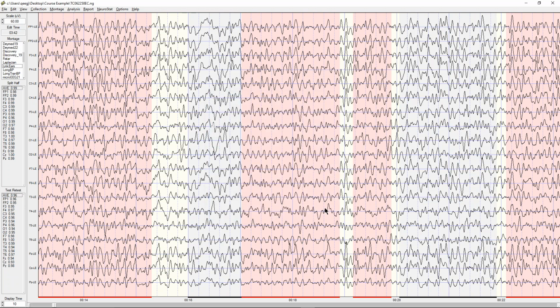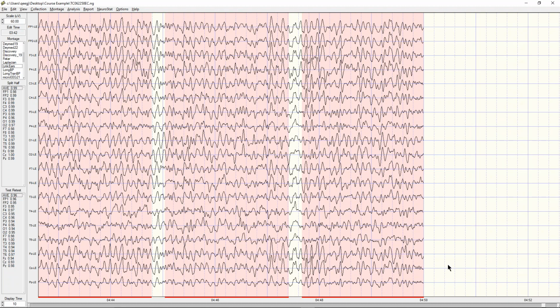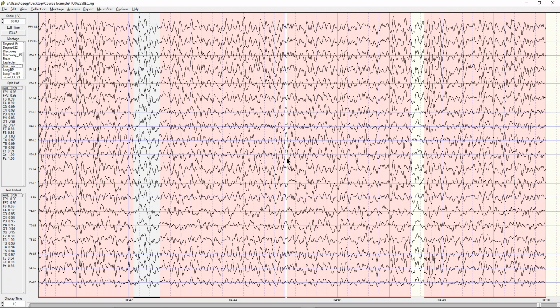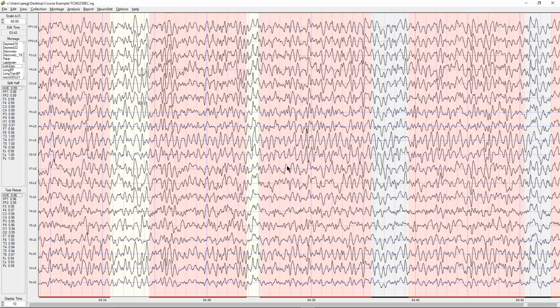So I'm going to click Close, but then I'm going to actually go through the entire recording to make sure that it hasn't made any gross errors, and include things that it hasn't included that I think are acceptable. EEG.